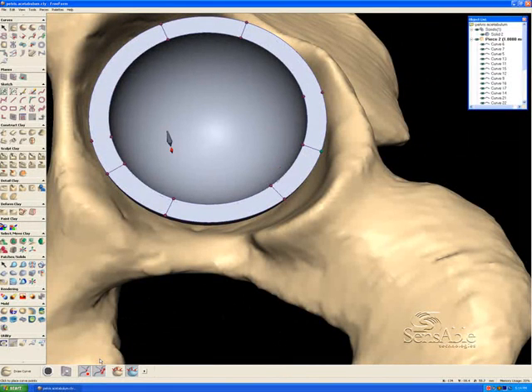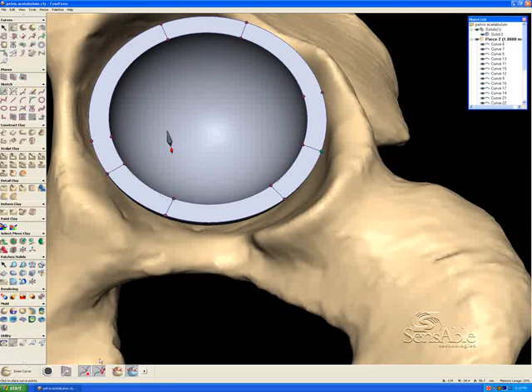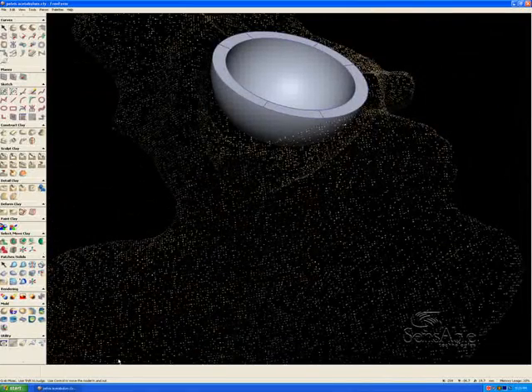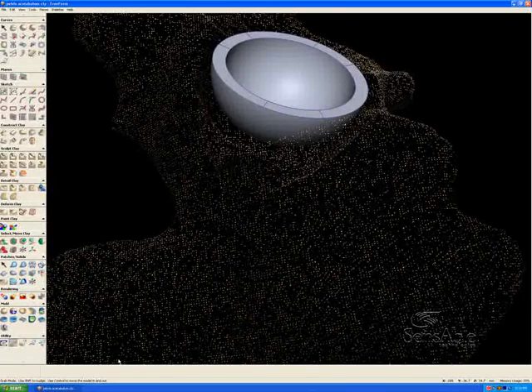The next thing that I want to do is create some additional curves, but these curves are going to be fit to the pelvis. So instead of, let's delete that, instead of fitting to the solid, I'm going to click this button here, which is Fit to Clay. And so let's do this curve network right here. I'm going to fit these curves to the clay. 1, 2, 3. And hit E to end that curve, and 1, 2, 3, 4 down here.